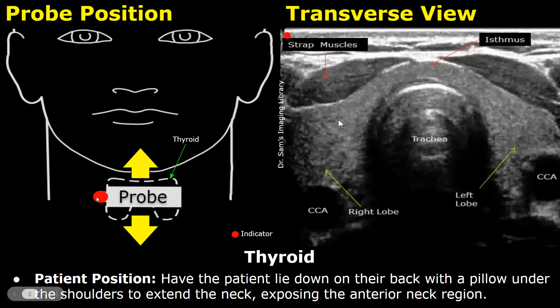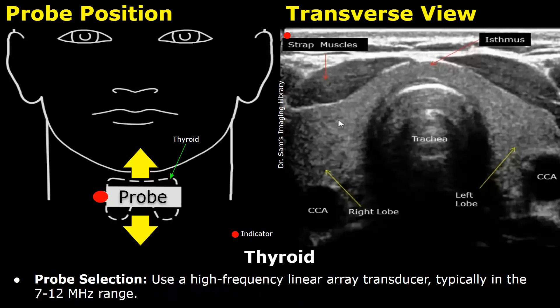Have the patient lie down on their back with a pillow under the shoulders to extend the neck, exposing the anterior neck region. Use a high frequency linear array transducer, typically in the 7 to 12 megahertz range.